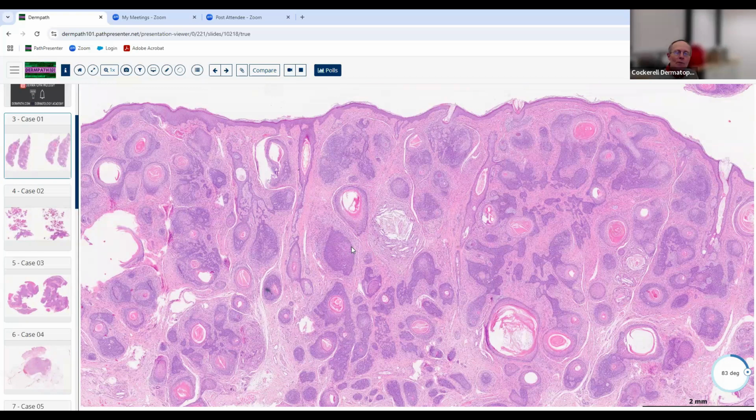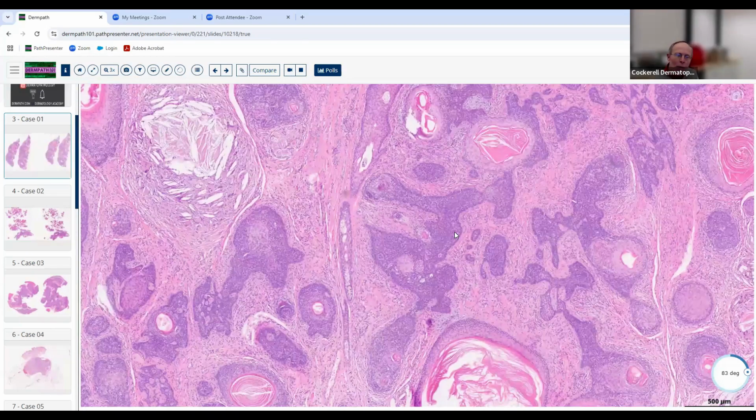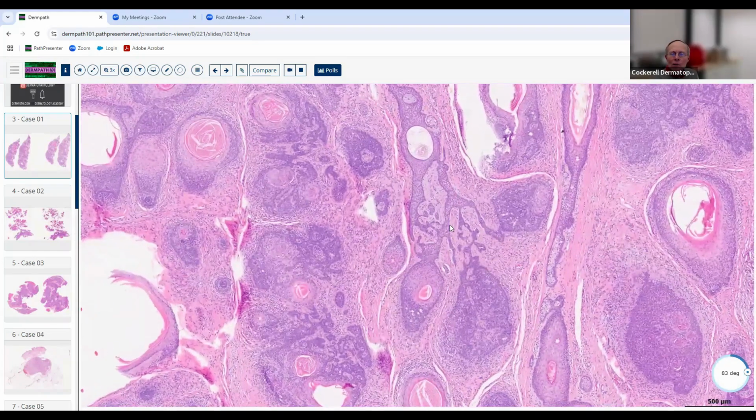Then you have to have a little bit more sophistication to take it all the way over the goal line. So you have to say, well, okay, now that we know that's follicular, what else can we use for criteria to help us make the diagnosis? And if you see structures like this that are obvious, well, they're primitive, they're obviously hamartomatous, but you can make out that these are hair follicles here. There's a little mini hair follicle sitting right here. You've got the little cyst-like structures. You've got this little area over here that looks like it came off the mantle zone, these little sort of reticulated follicular structures right in here that are primitive as well.